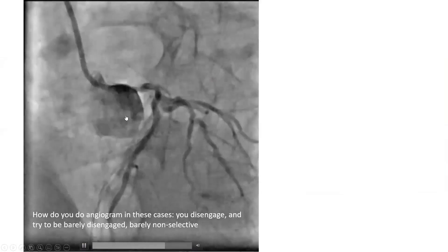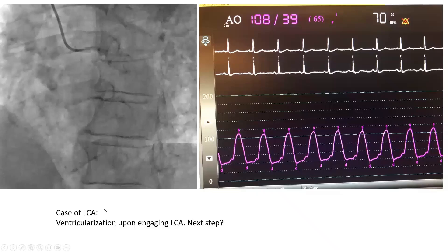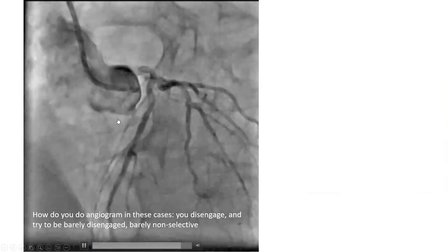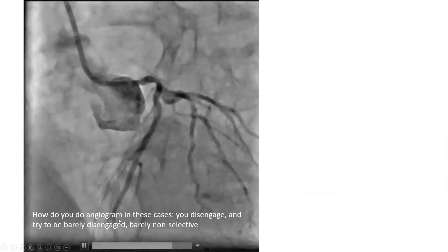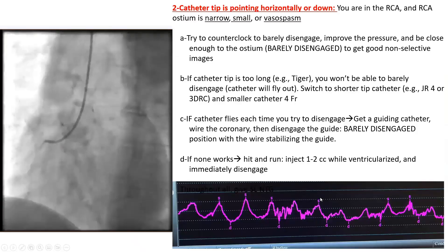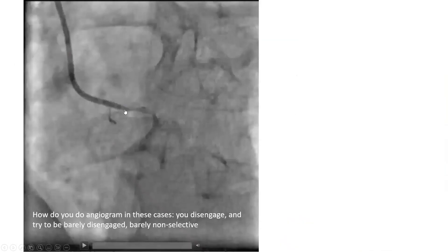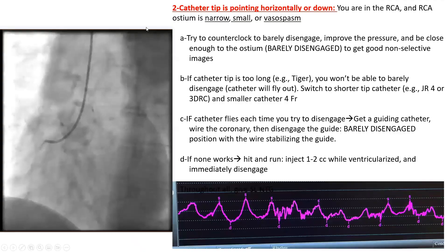This applies for both left and right coronary. In another case where we were ventricularized engaging the left main, we did our angiogram with a good waveform while barely disengaged — you can see we're disengaged here but close enough to see the vessel. Sometimes you try to be barely disengaged but the catheter flies out and you cannot maintain that fine position. What you can do is get a guiding catheter, wire the coronary, then disengage — the coronary wire will stabilize the guide so you can maintain a barely disengaged position.